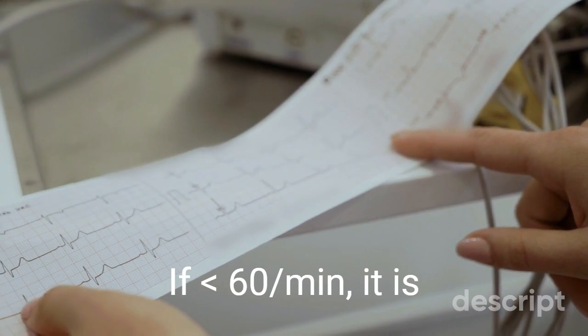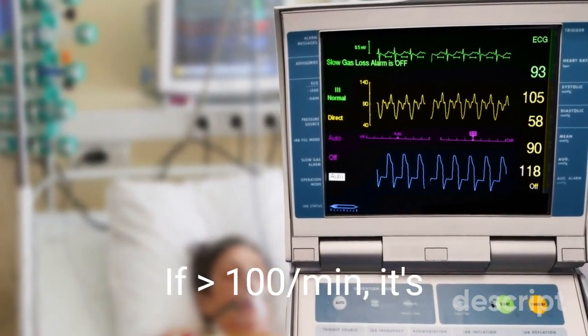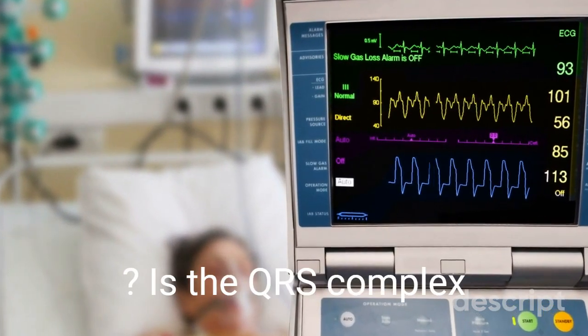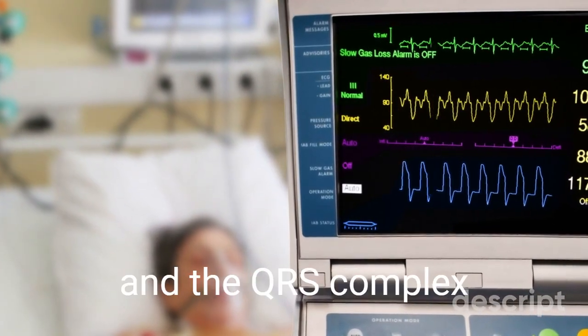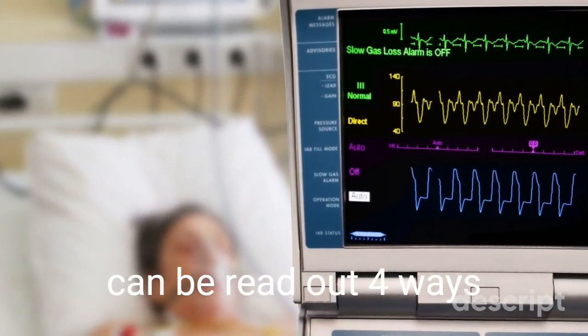If lesser than 60 per min, it is called bradycardia. If greater than 100 per min, it's called tachycardia. Rhythm looks at 4 things. Is there a P-wave? Is the QRS complex wide or narrow? What is the relationship between the P-wave and the QRS complex? See if the rhythm is regular or irregular. It can be read out 4 ways.